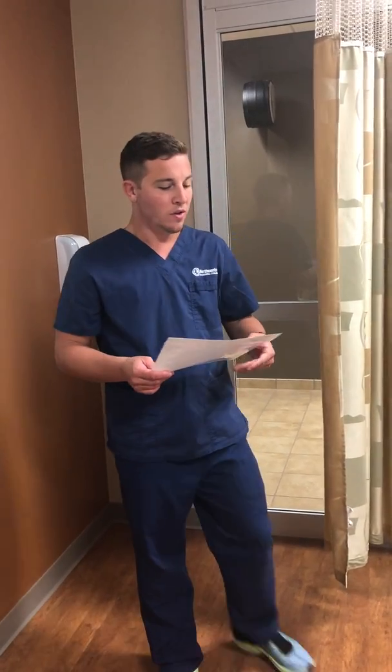I'm going to demonstrate how to change a dressing to a chest tube. So I'm looking at my order and my patient. I have Jennifer Doe, date of birth 11/5/1975. She has no known drug allergies, and I have an order to change the dressing to her chest tube.